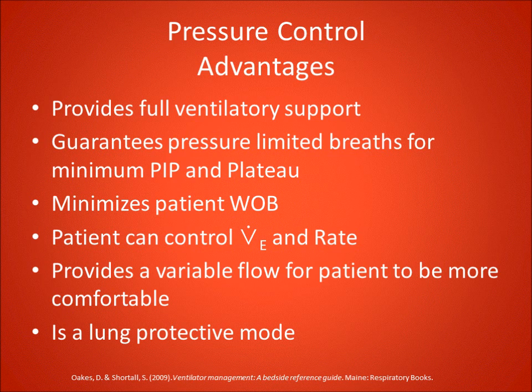The advantages of pressure control is that it provides full ventilatory support. It guarantees pressure-limited breaths for minimum PIP and plateau. It minimizes the patient's work of breathing. The patient can control their minute ventilation and their rate. It provides a variable flow for patients to be more comfortable, and it is a lung protective mode.